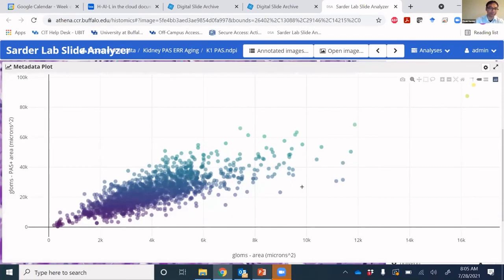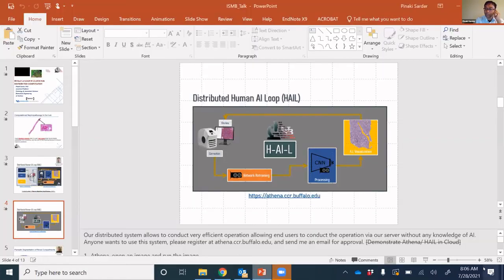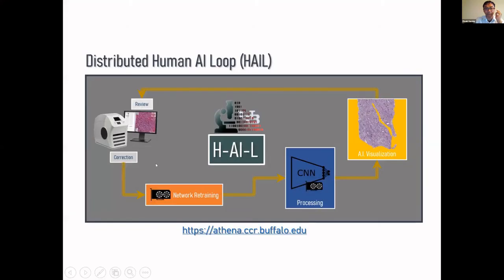Imagine that a physician is looking at their slide, and if we can make this tool a global repository, someone with a suspected tissue, where they are not sure of the lesion or the diagnosis type, can calculate features and project the data here, and query the system to find out what other disease types match the tissue they are looking at. With that being said, I will just show very quickly the different types of things that we can segment.